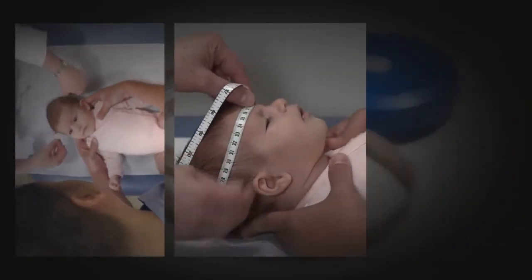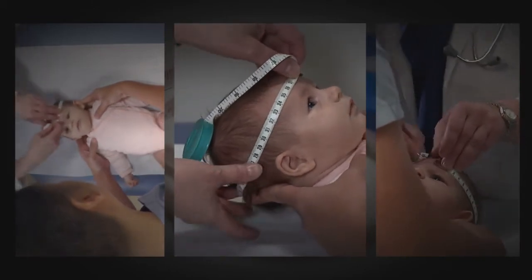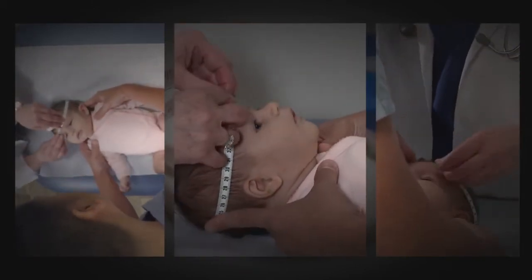We recommend that you reposition the tape and repeat the measurements three times. Record the largest measurement to the nearest 0.1 centimeters.